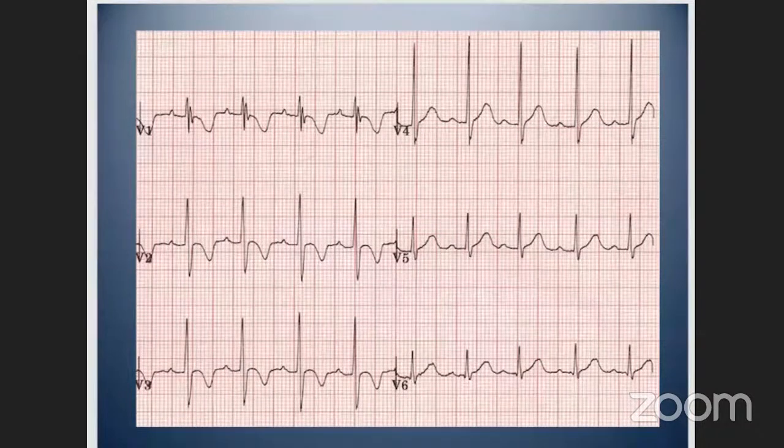It was a bit of a tricky one, but yeah, Shiraz, definitely good insight with regards to the inverted T waves and the RSR pattern.